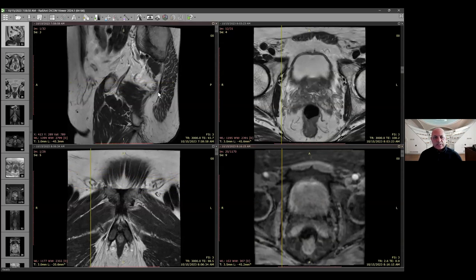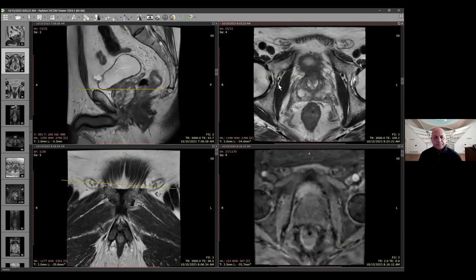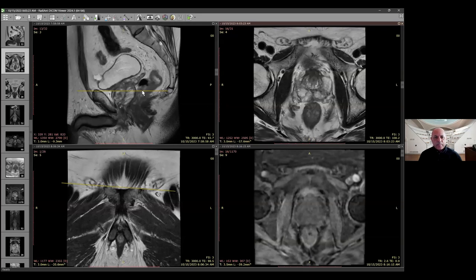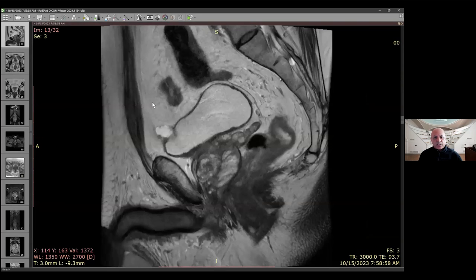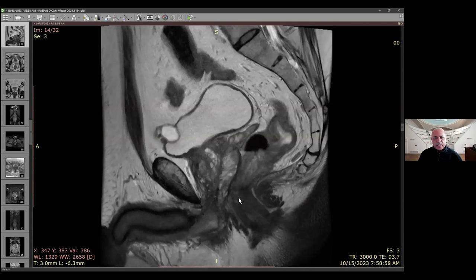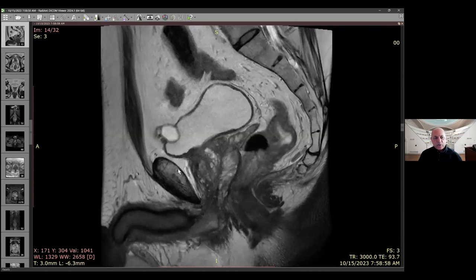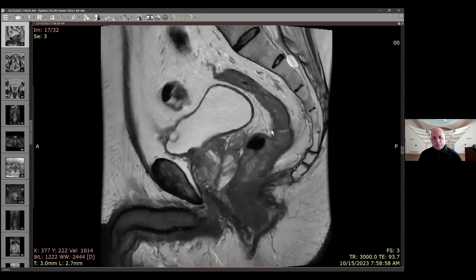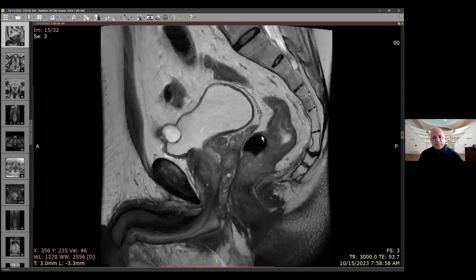As I scroll through the axial, the corresponding plane on the sagittal is a straight axial. One can ask: do we typically do a straight axial or angle it to the prostate? There are two things to keep in mind when angling: first, you must be familiar with the anatomic distortion that results. Second, if you do your axial in an oblique plane, you need to make sure your enhanced images and DWI are also in the same plane, otherwise cross-correlation becomes difficult. With modern PACS, the cursor can co-localize, but it's still easier if all three transfer planes are in the same oblique plane.